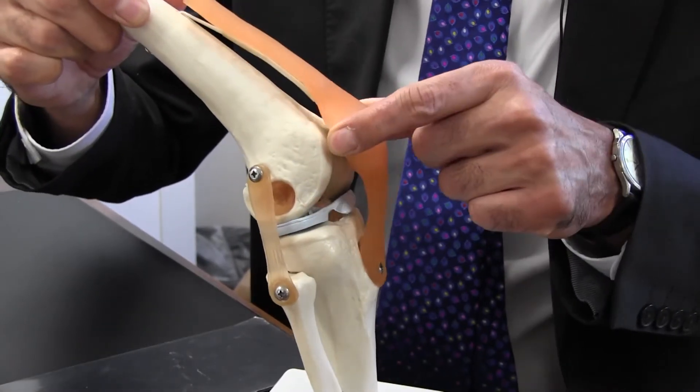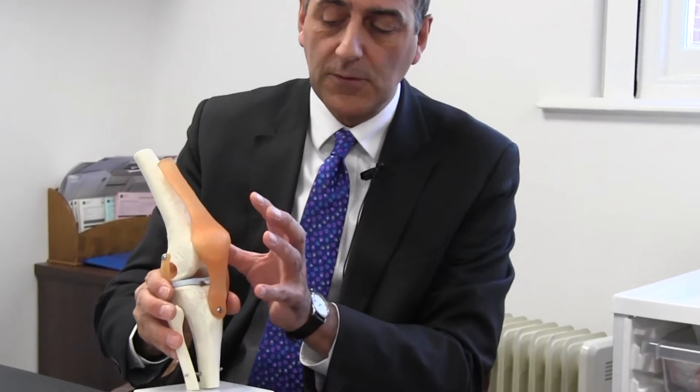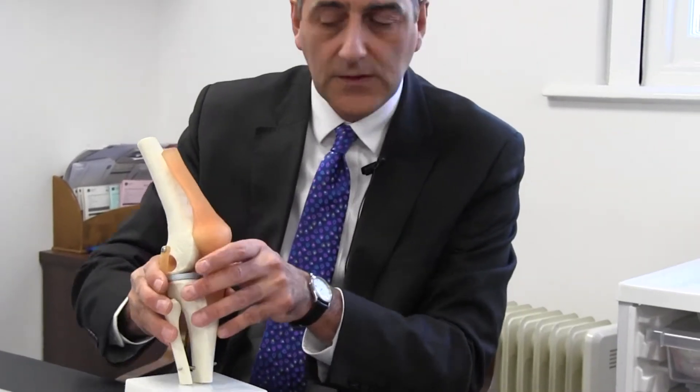To give you an idea of what a knee replacement actually means in practice from a surgical point of view, this is a model of a normal knee joint — this being the front patella, the femur, and the tibia. A knee replacement isn't actually replacing the entire joint; it's actually a resurfacing operation.